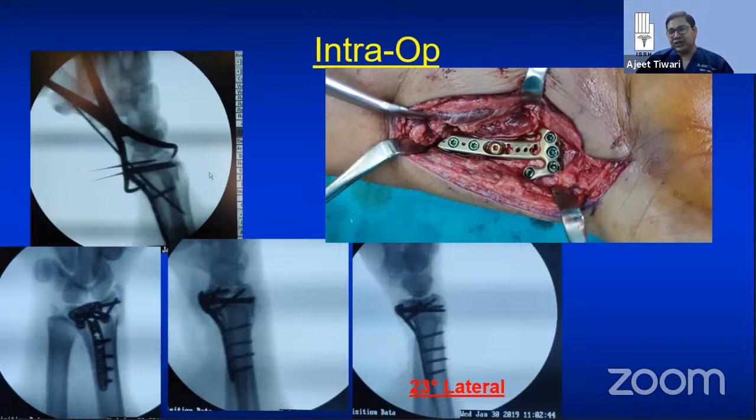It should be 2 to 3 millimeters shorter than exactly what is required. So it should not cross the dorsal cortex, because if it pierces the dorsal cortex, it will probably irritate the extensor tendon. What the literature says is that whether you pierce the dorsal cortex or stay subchondral, under the dorsal cortex, it doesn't make a huge difference in the outcome.